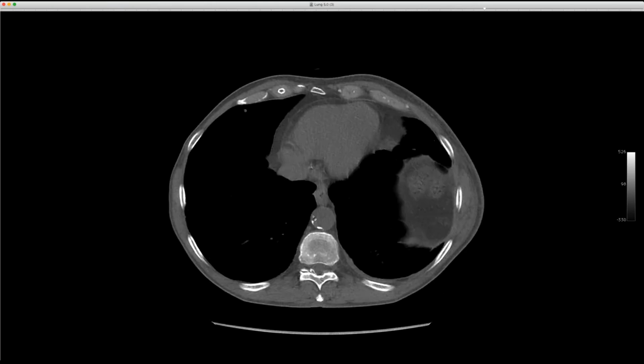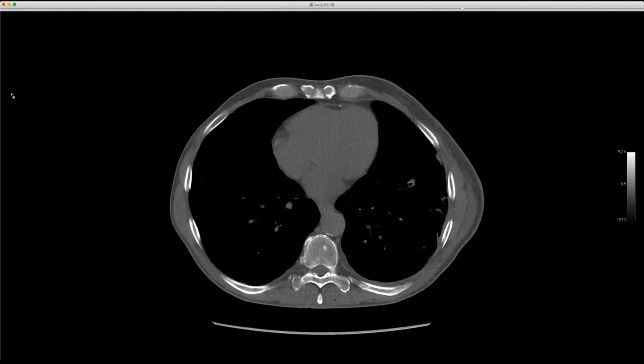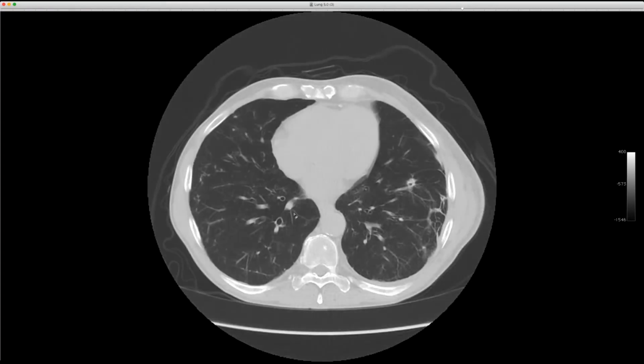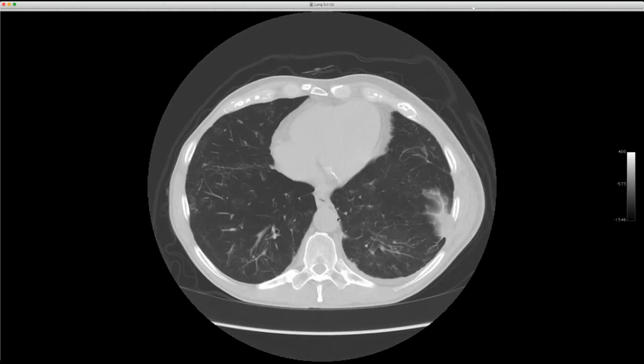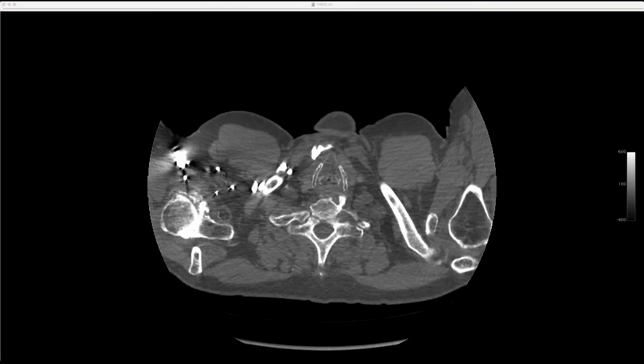So this was a bad blasto case that didn't radiographically clear, but he improved and his antigens turned negative. They use a urine antigen. They treat them usually for 9 to 12 months with an antifungal. I think itraconazole is the one of choice. And this is sort of the sequela. So this is the first time I've seen blasto leave nodules behind, and I thought that was kind of interesting. So those were two cases of that.